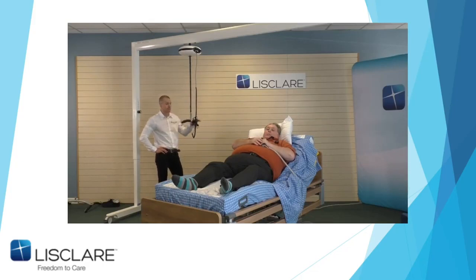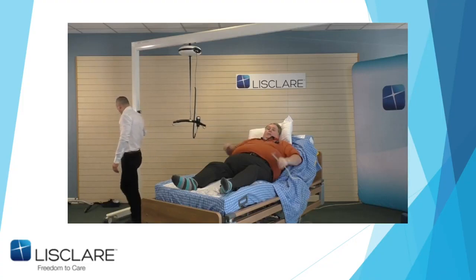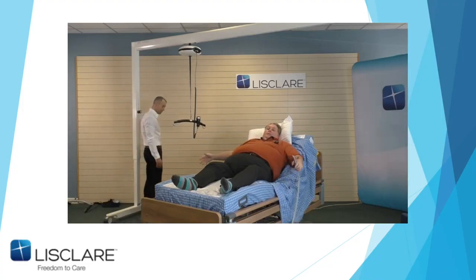That's just 3 to 4 different ways of getting somebody back up the bed, as well as the classic where there's 2 carers where they're actually just treated like a slide sheet, and then they can lock it out. Just to explain quickly about locking out, you can slide this up against itself, or you can tuck it in.